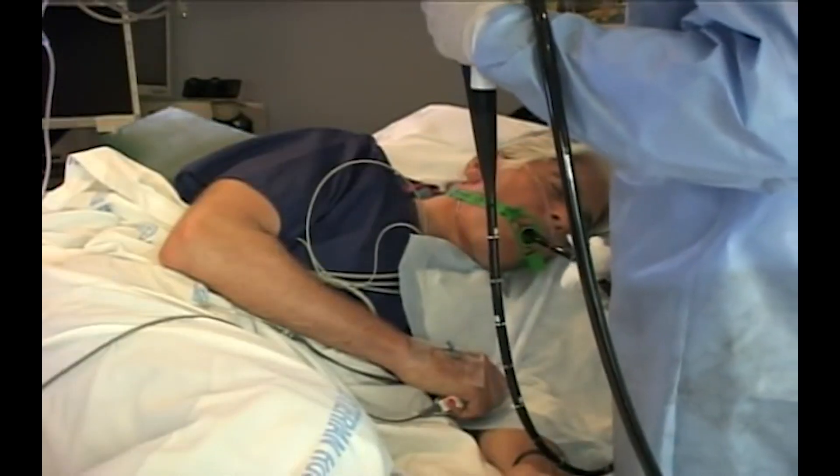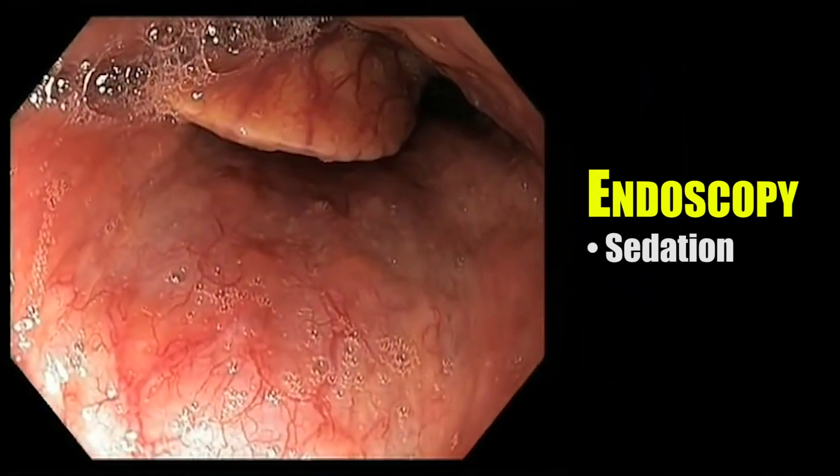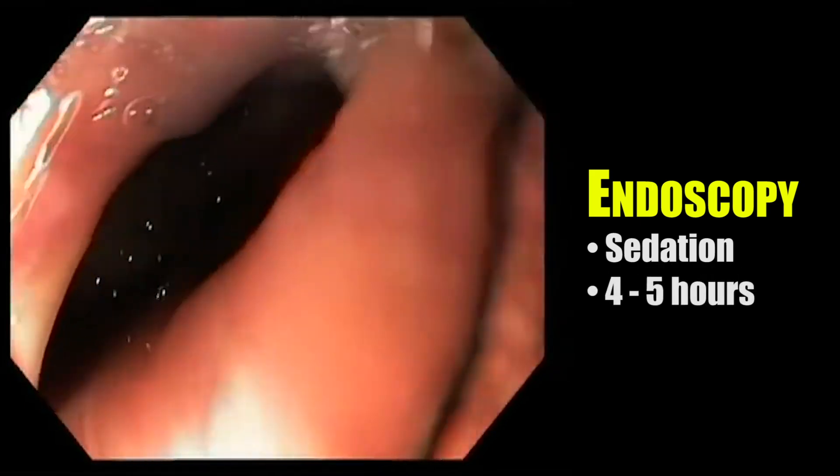Until now, the only way to detect esophageal cancer would be with an endoscopy, where patients are sedated. A flexible camera is fed through the mouth, down to the stomach, taking four to five hours out of the patient's day.